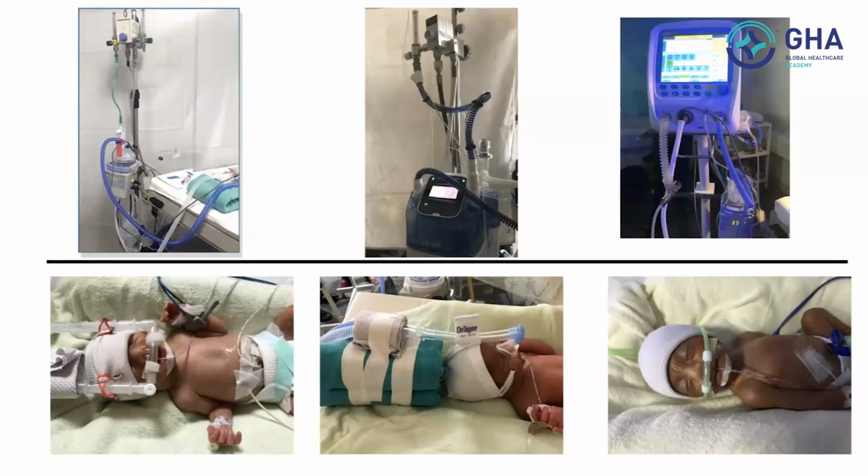for generating the pressure. So these are the requirements for giving CPAP, and it can be given with any one of the interfaces. What interface will you prefer? Whatever your unit is using more frequently. The more experience you have in using any interface, the better will be the outcome, lesser will be the nasal injury, more will be the efficacy.